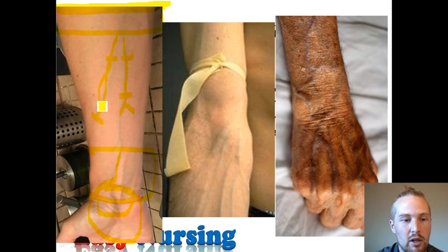It looks like we have another vein here. It's a little bit harder to see, so I'd probably go for one of these 2 first. I do have a bit of straight from here to here. If I were to start right here, I'd have that full inch to start an IV, so I could start right here. So those would be some options.